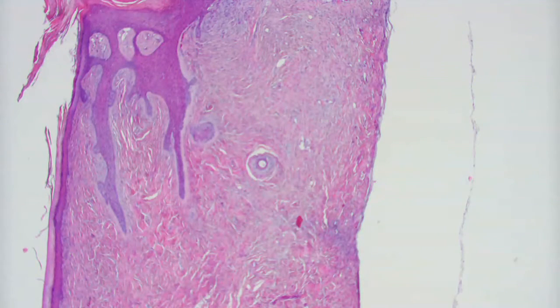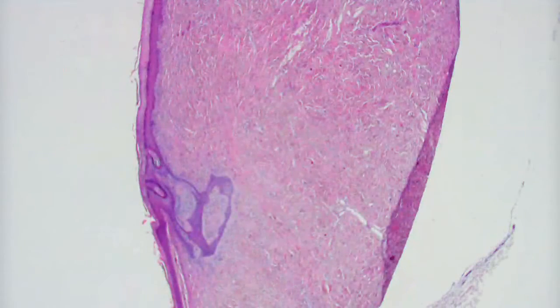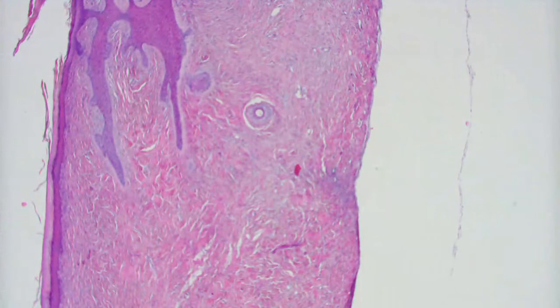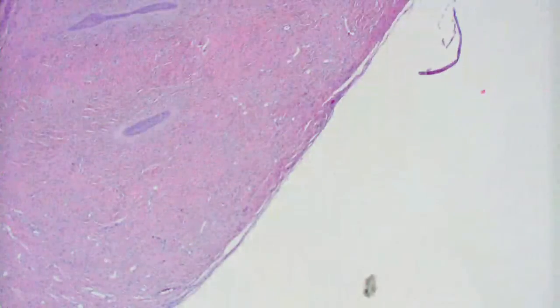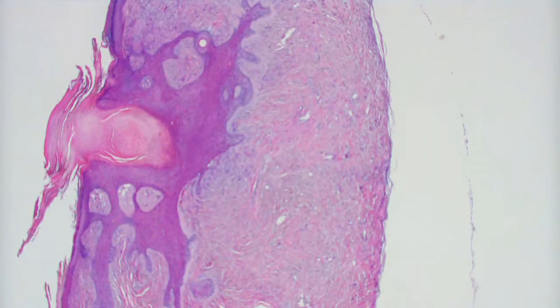There are these little follicular elements within the dermis, in that section and also in the other one. But I didn't think this was enough. I didn't think this was the stroma for a follicular tumor. I thought it was too cellular. Some of the bits on the other piece have that storiform look. I didn't think it was a sclerotic fibroma or anything like that, so I wasn't sure which direction to go on this one, and ended up calling it a DF.